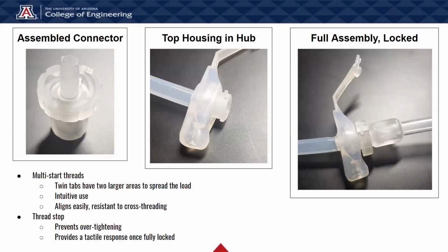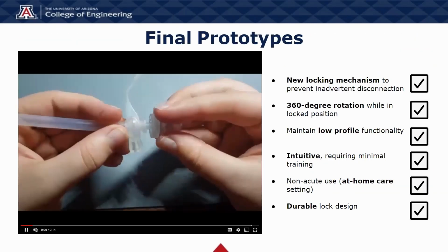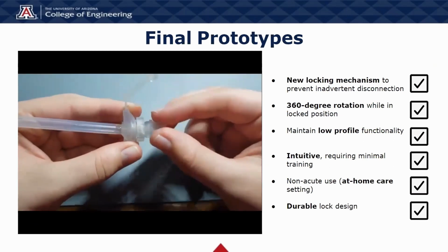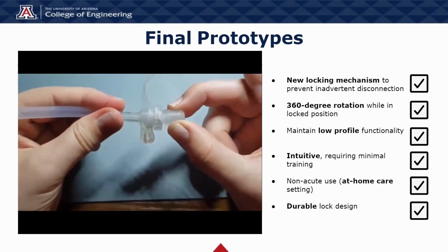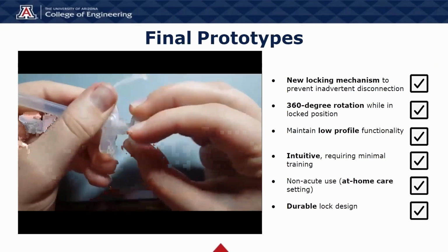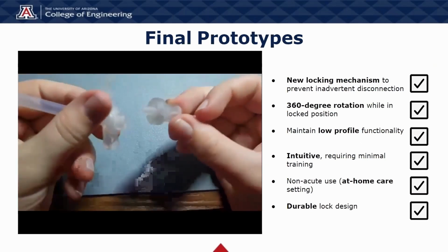We're also, with the two halves of the locking piece, able to create thread stops, which prevent over-tightening and also give a good tactile sensation once the system is fully locked. Here's a video of our final prototype in action. You can see it screws on, and then any manipulation of the valve connector will not undo that lock. So you have no chance of it tangling or coming undone when you don't expect it.